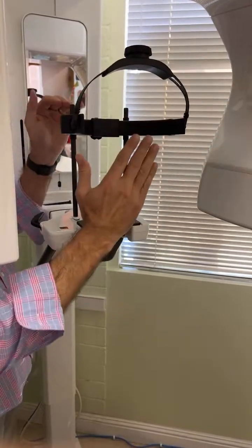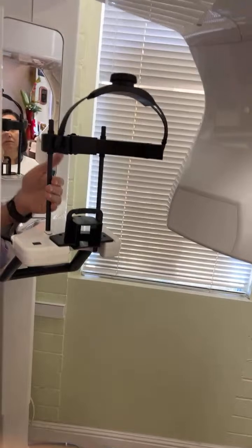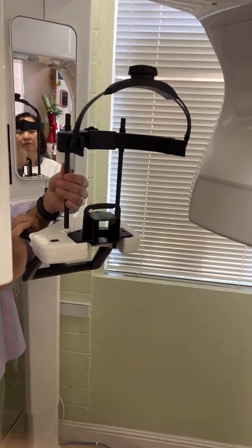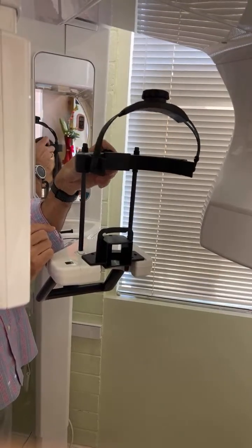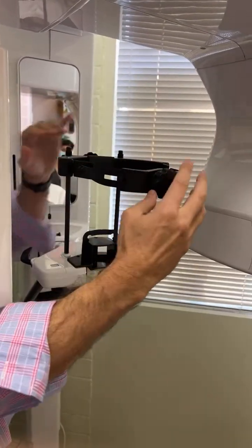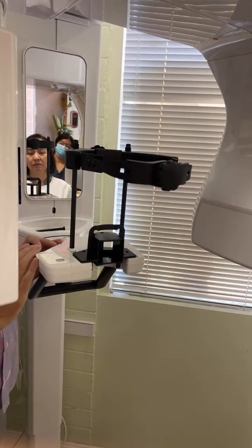Okay, so they're going to come in, chin here, you do your positioning, then you would release this and have it touch the forehead, and then lock it. This will go up and down for smaller or larger heads. Then you would close the temporal. And the last thing you would do if you want is to ratchet this in. So you have all these contact points to keep the patient stable.